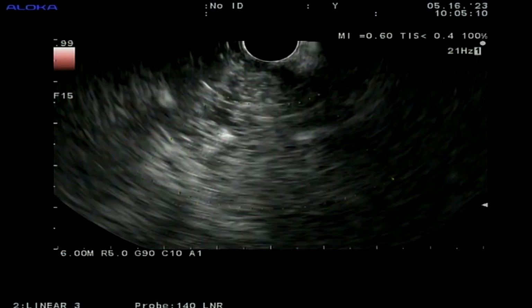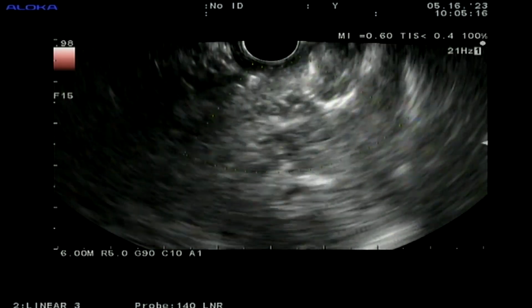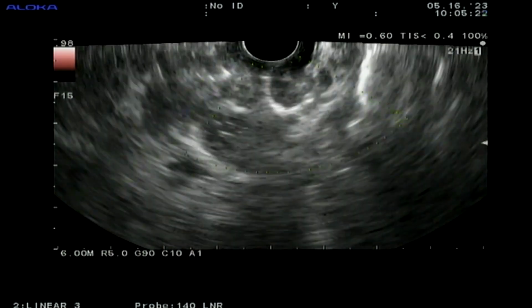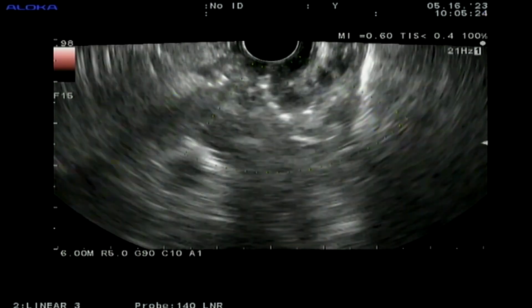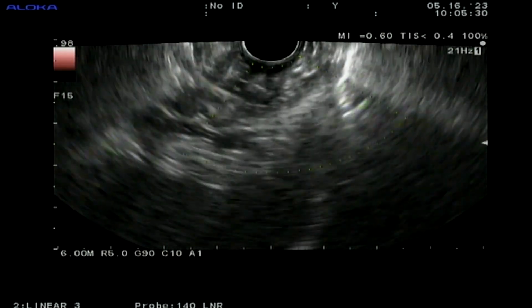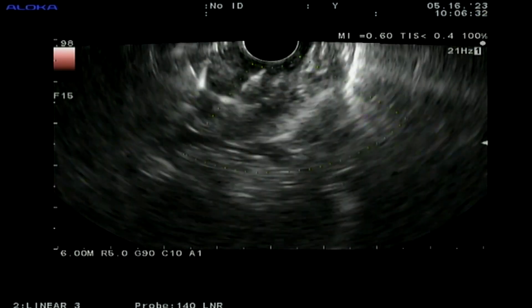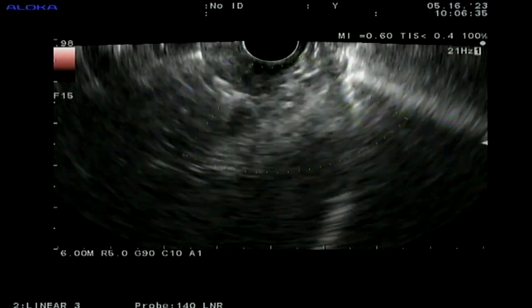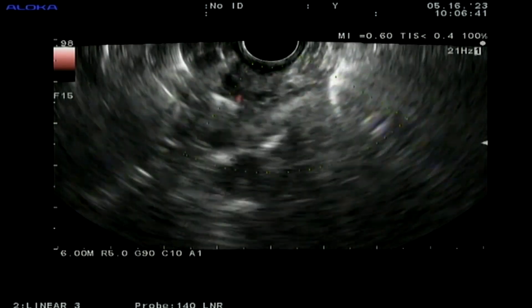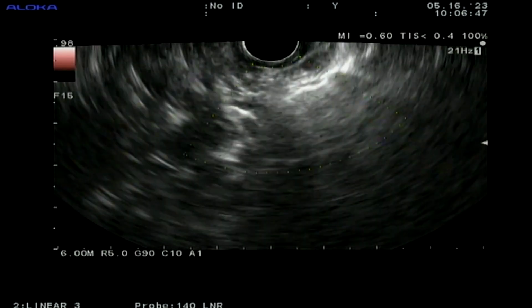We'll throw on the Doppler, and really what we're interested in is just to see if there's any very obvious areas that may need some additional treatment. But we'll just hold very still here. Movement, of course, will create a little bit of Doppler flow. And very slowly pulling back so that as I pull back to look transesophageal, transcrural, hopefully I can see the outline of the stomach. So you can see now the outline of the stomach still. There's the crus muscle coming and popping just a little bit further back.